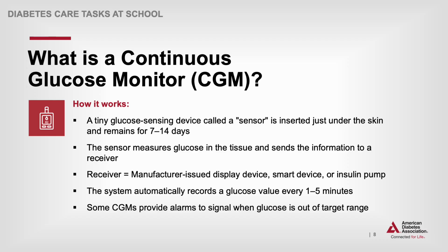While continuous glucose monitors are becoming more common, they are still not used for all students with diabetes. Some individuals use them daily, while others use them for a short period to give the healthcare providers a picture of what is happening with glucose levels between monitoring times, particularly after meals and at night while sleeping.